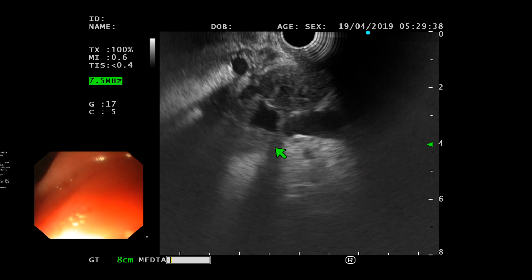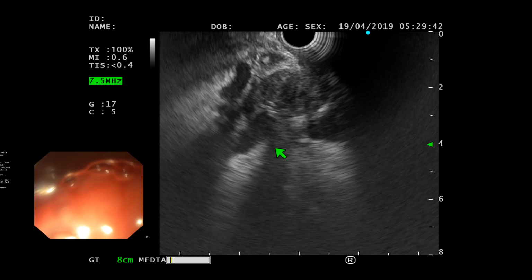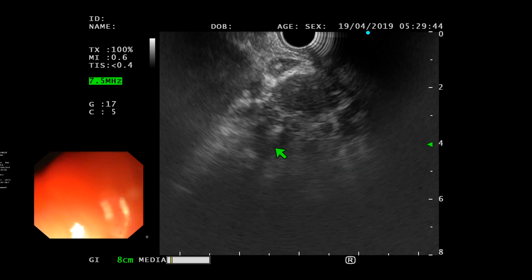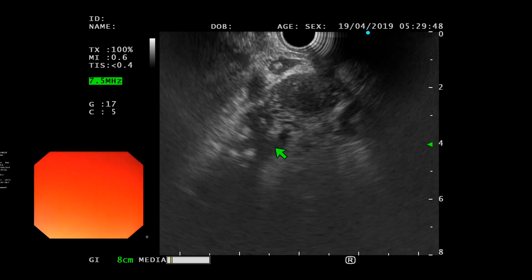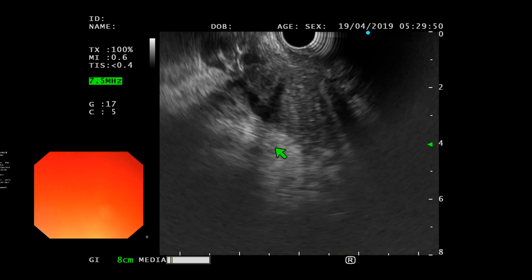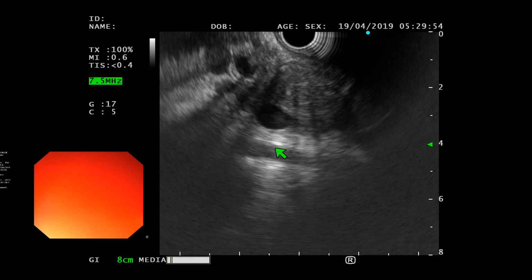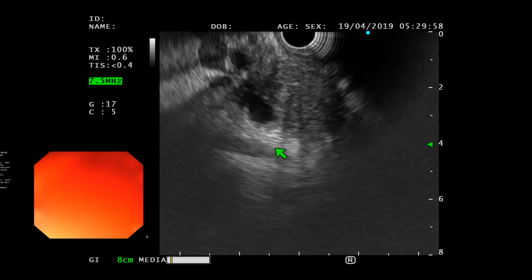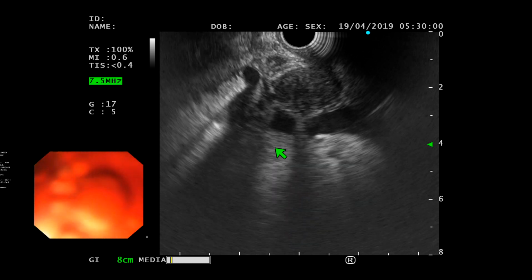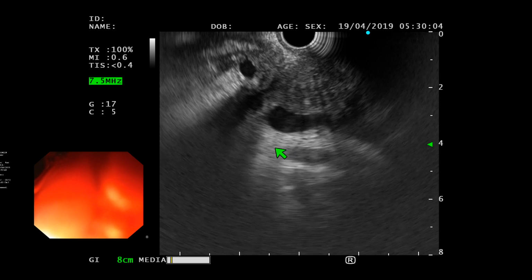Thank you. So, just looking at it, do you think that there could be potentially a component of chronic pancreatitis, or do you think this is purely malignancy? Just by appearance, what's your overall suspicion? So this is where, if you don't mind and allow me to say, I use elastography. Sure. No, we're here to learn, so that's why I'm asking the question. Either way you would sample it, right?